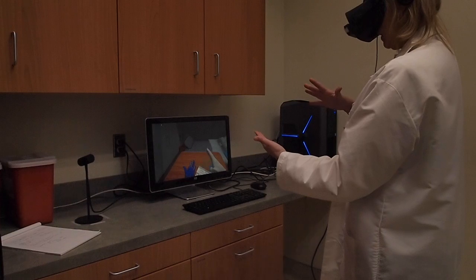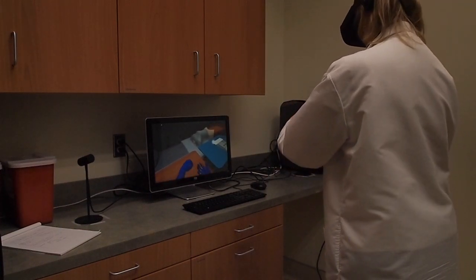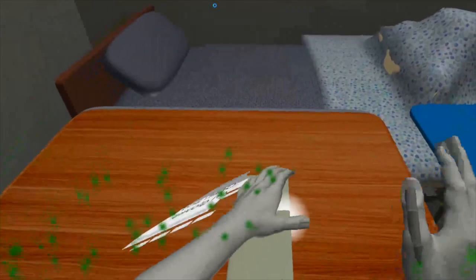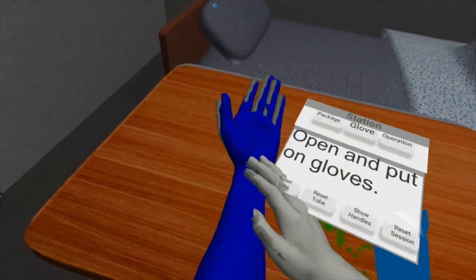Put on the left glove — letting go of it is what puts it on your hand. Then put on the right glove. Here it is again: left glove, then right glove.